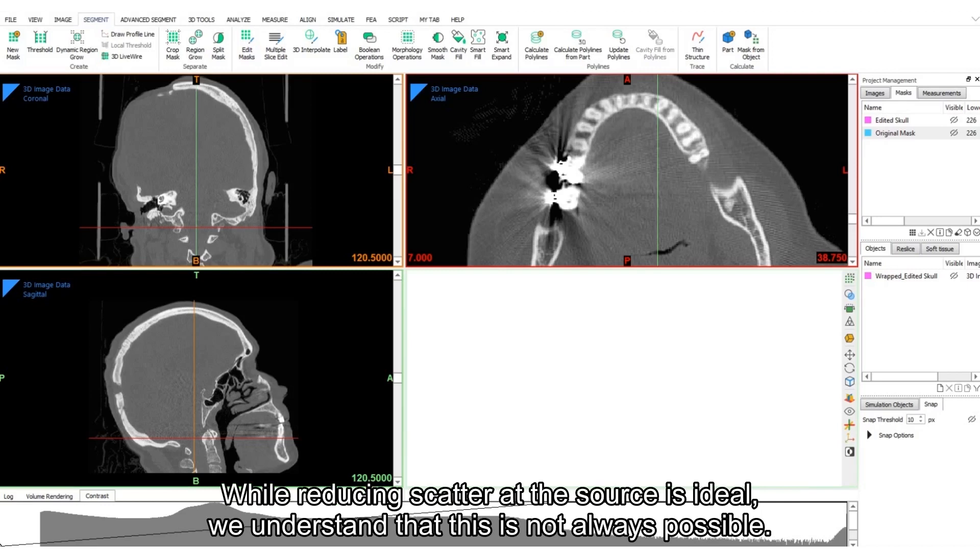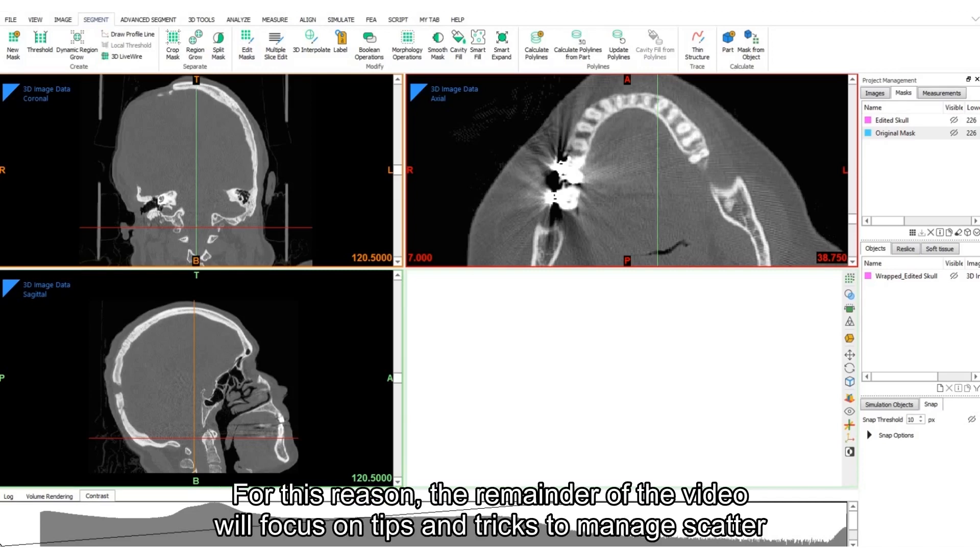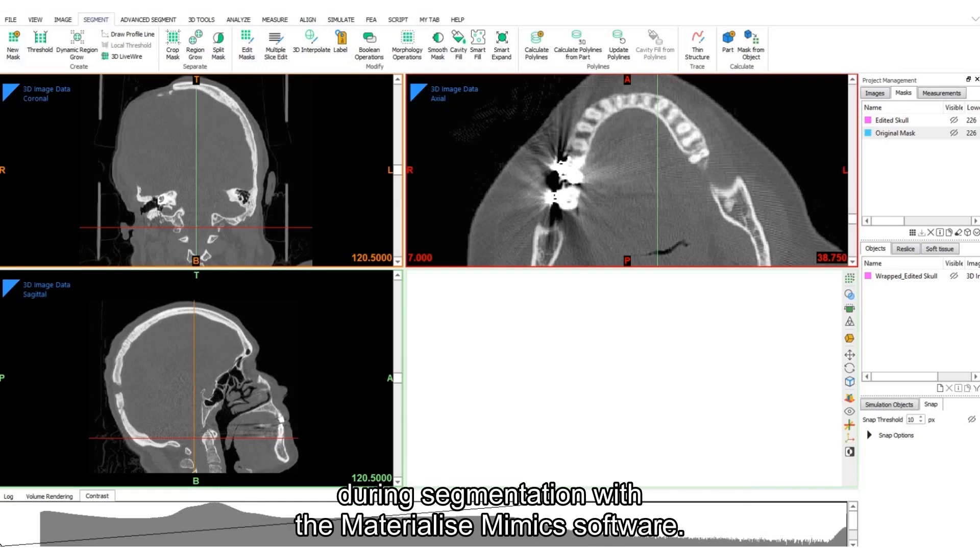While reducing scatter at the source is ideal, we understand that this is not always possible. For this reason, the remainder of the video will focus on tips and tricks to manage scatter during segmentation with the Materialize Mimics software.